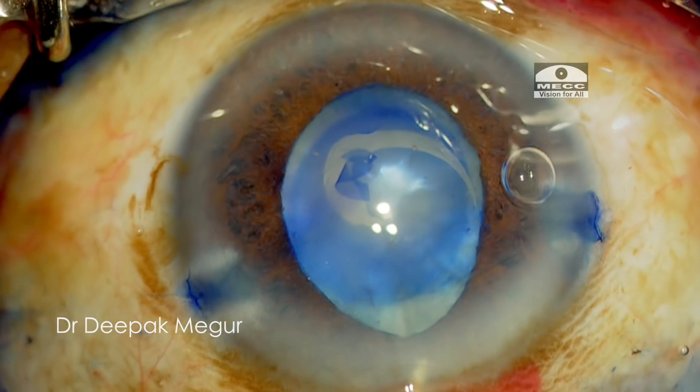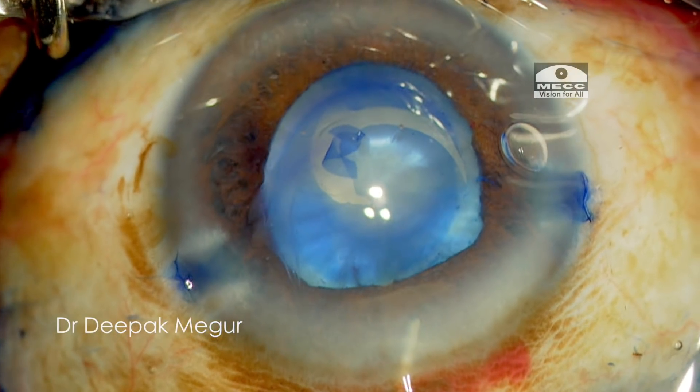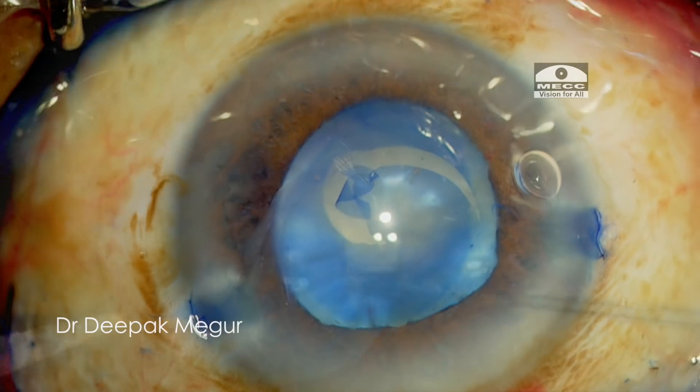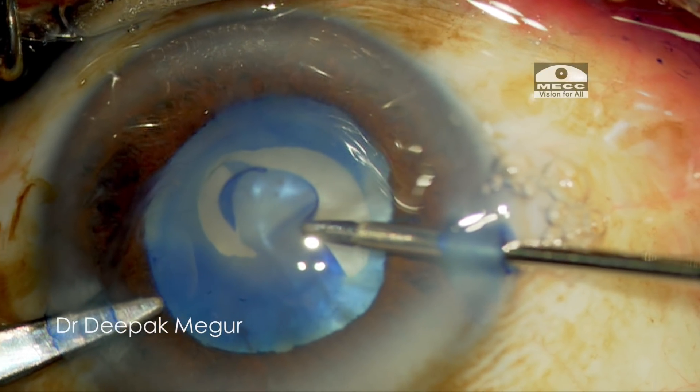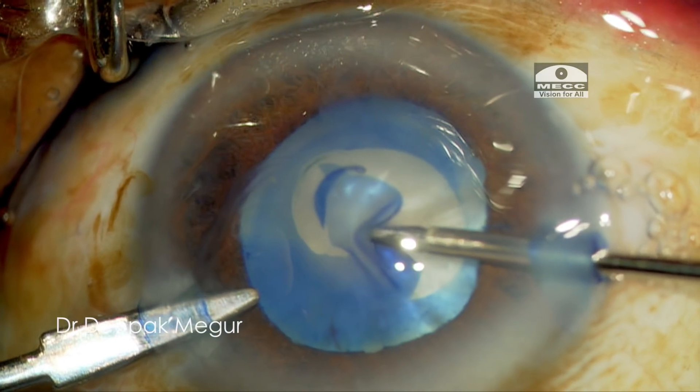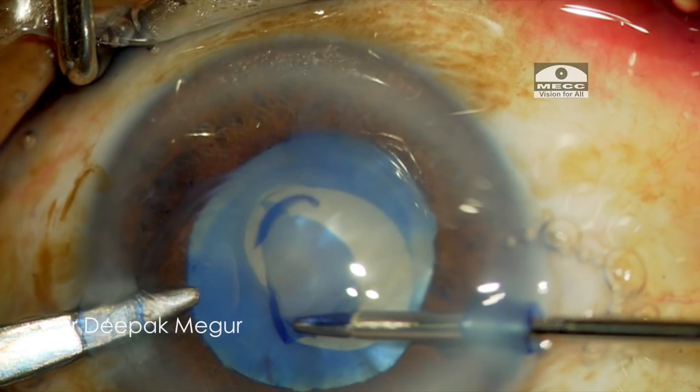The chamber is shallowing, so I inject a little bit of OVD again and change my angle of attack. I want to go back using a micro forceps but through the side port, because it's much more comfortable and easily accessible.